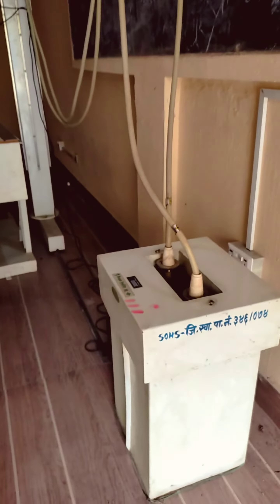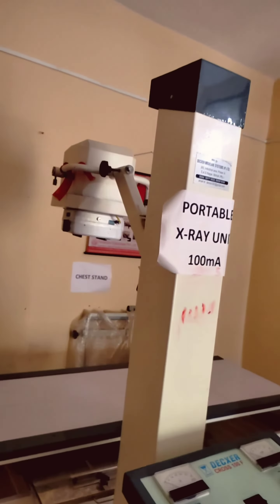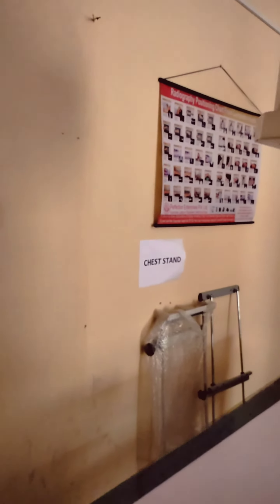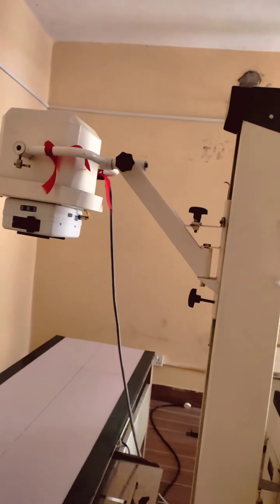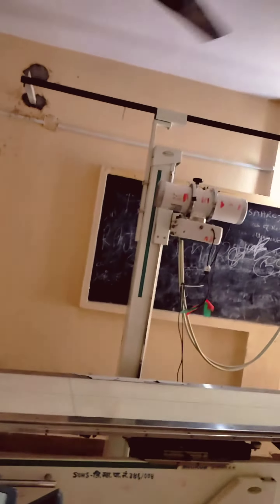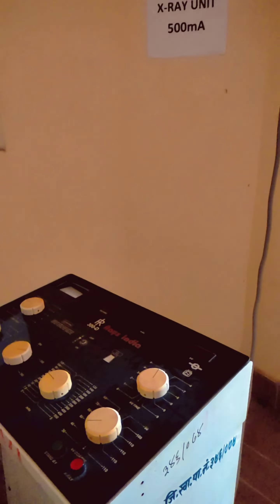I'm going to the lab, but you can see the lab from the machine. Here is the machine, here is the chest.